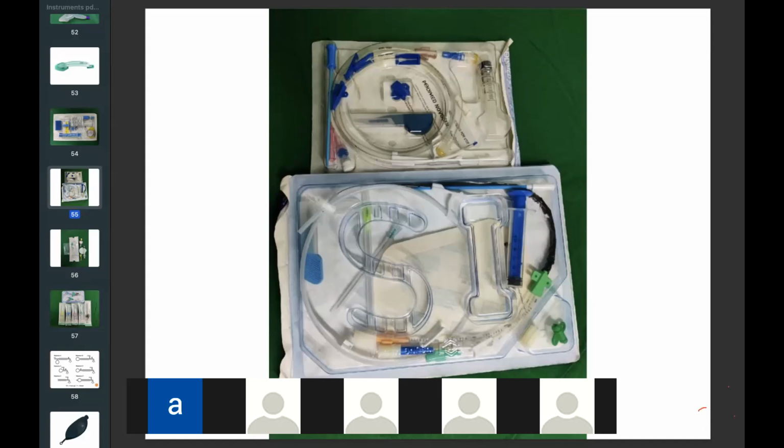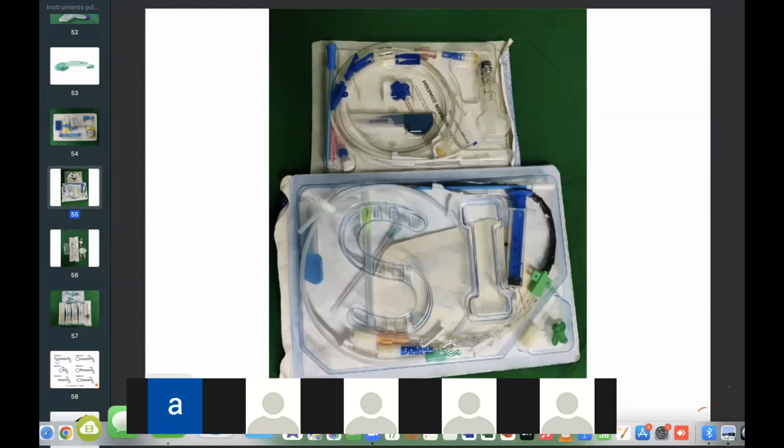Quickly. Yes, so first we position the patient and we attach the pulse oximeter and the ECG leads to the patient. We will remove the pillow and turn the head towards the opposite side. Then the patient is positioned in the 15-degree Trendelenburg position with a wedge of 6 to 10 inches below the shoulder of the patient, and head rings are to be removed.